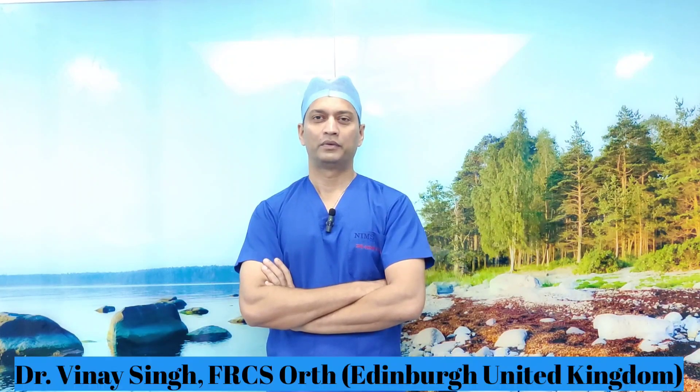Today I'm going to demonstrate a simple procedure in which we are going to inject a sacroiliac joint. A sacroiliac joint can be an infrequent cause of pain, and if non-surgical measures have failed to improve the symptoms, you can inject the sacroiliac joint with some steroid. This can serve as both diagnostic as well as therapeutic value. I'll take you step by step on how to do this injection properly.